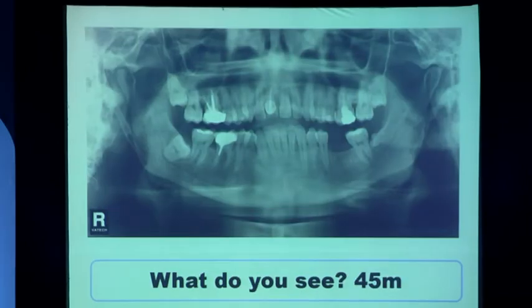Okay, this is fairly simple. This is a radiograph which is commonly encountered in all clinical practices. I think we see this kind of radiograph time and again, day in and day out. Fantastic, yes. This patient has Eagle syndrome, bilateral, wherein you see the entire length of the stylohyoid ligament involving the styloid process getting ossified bilaterally.